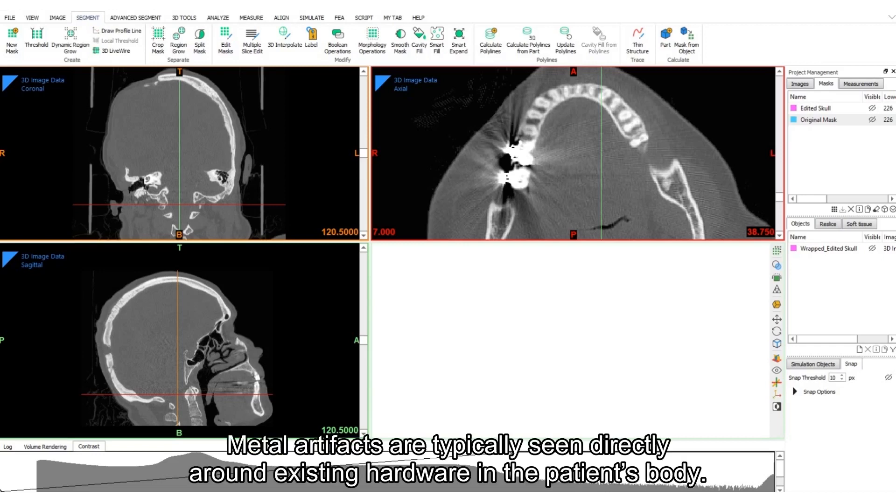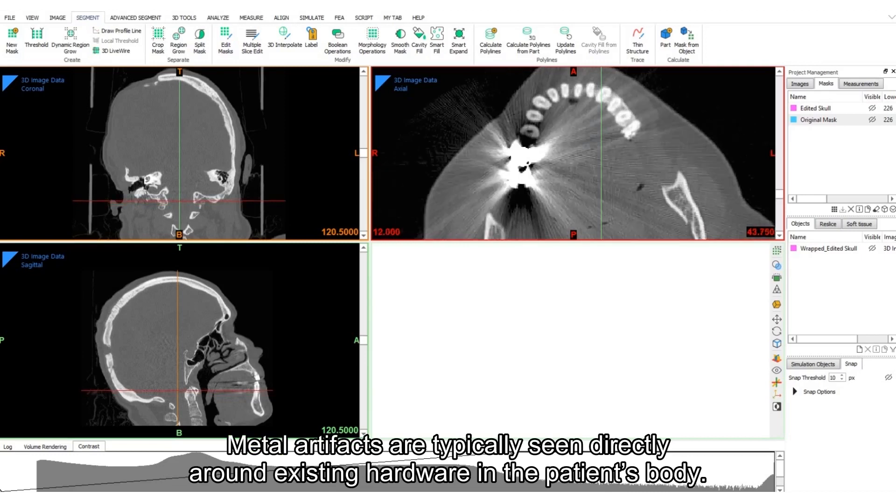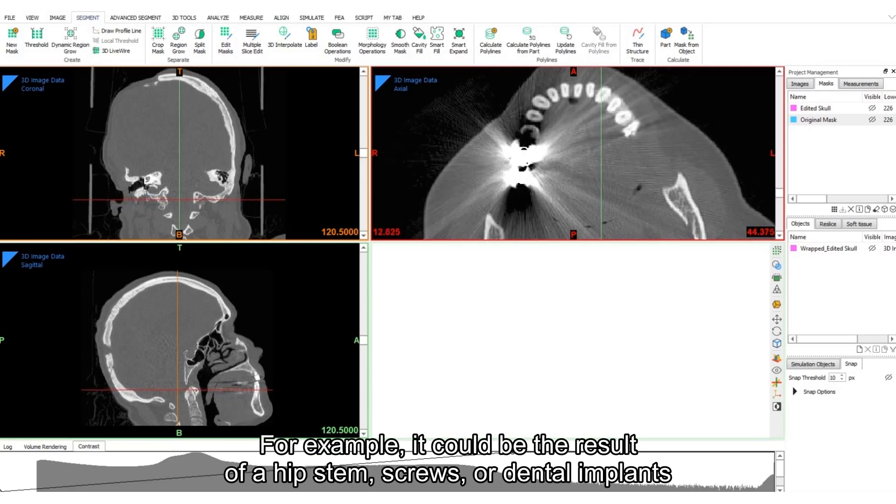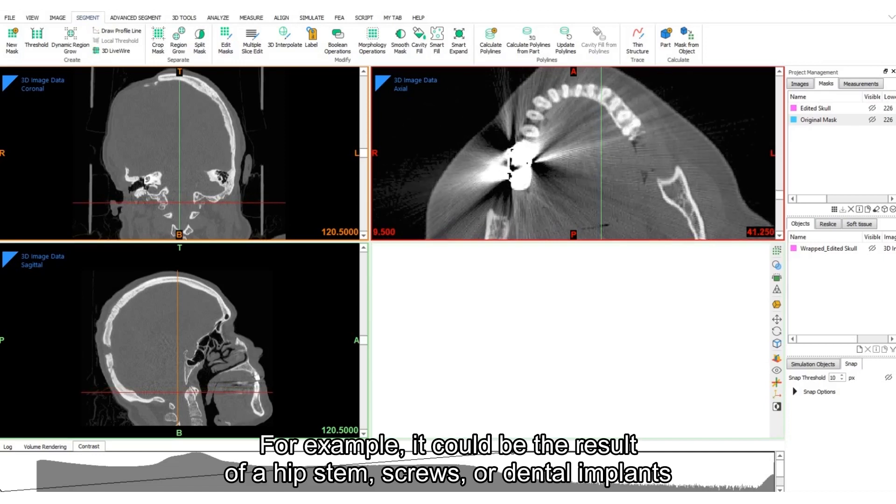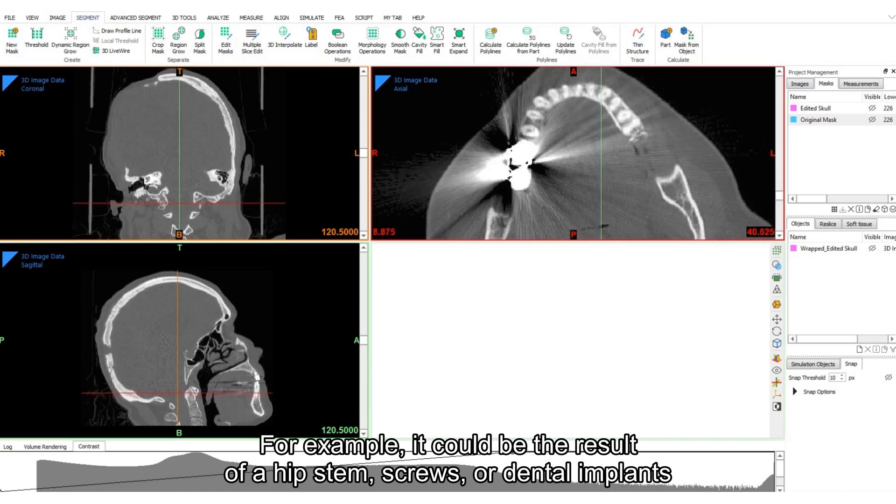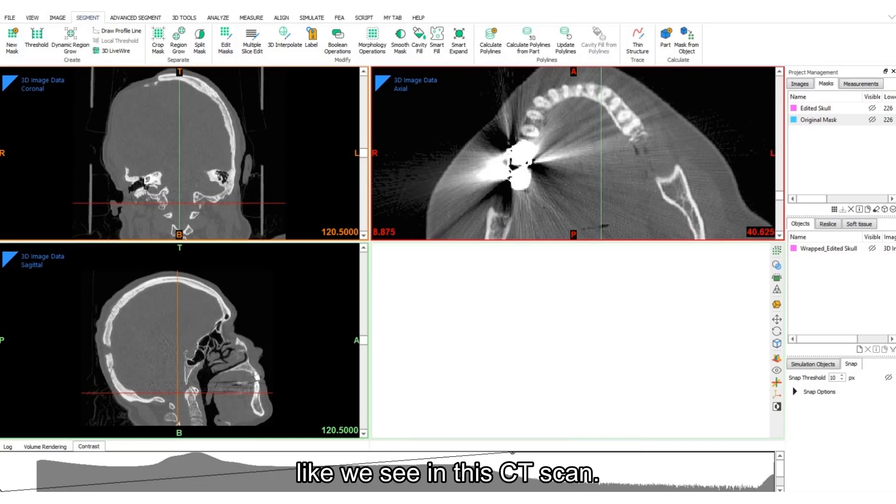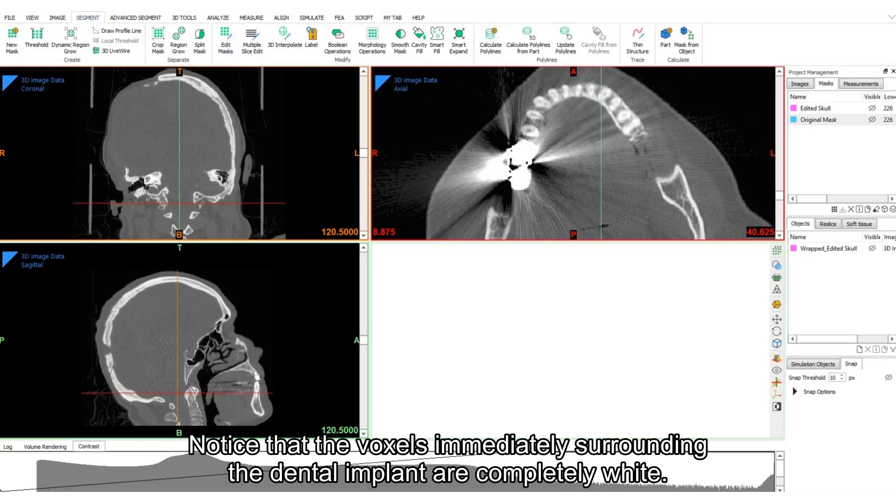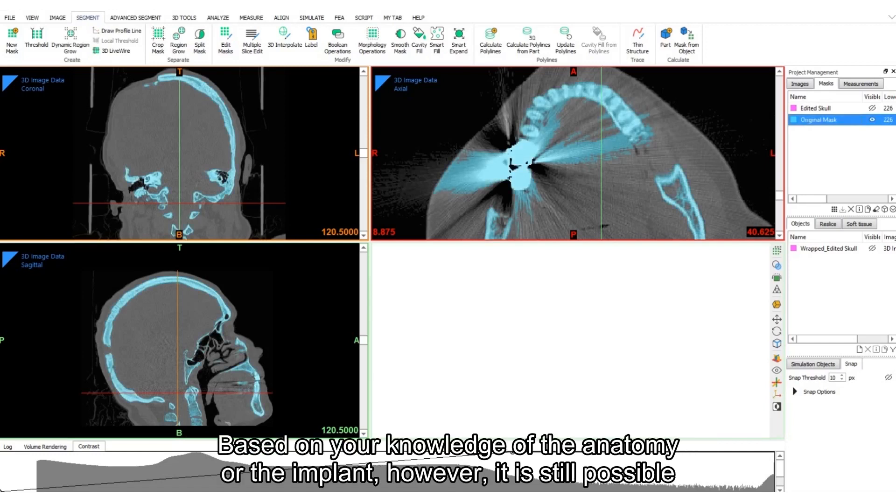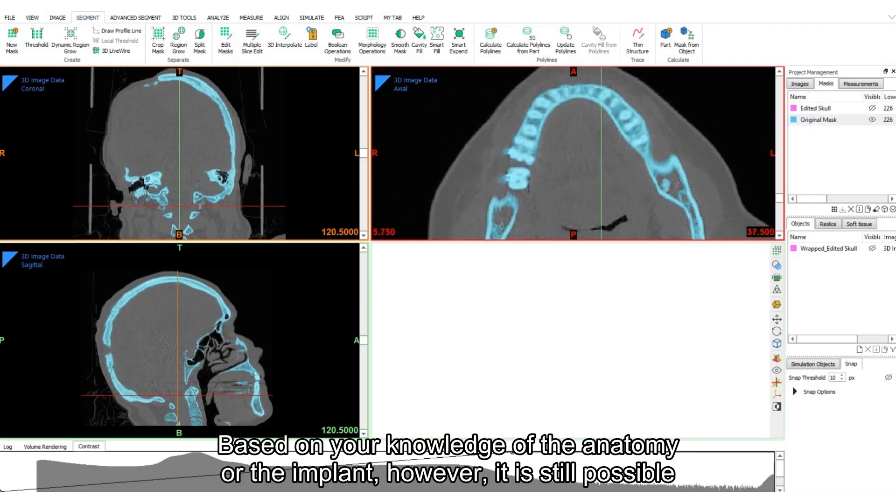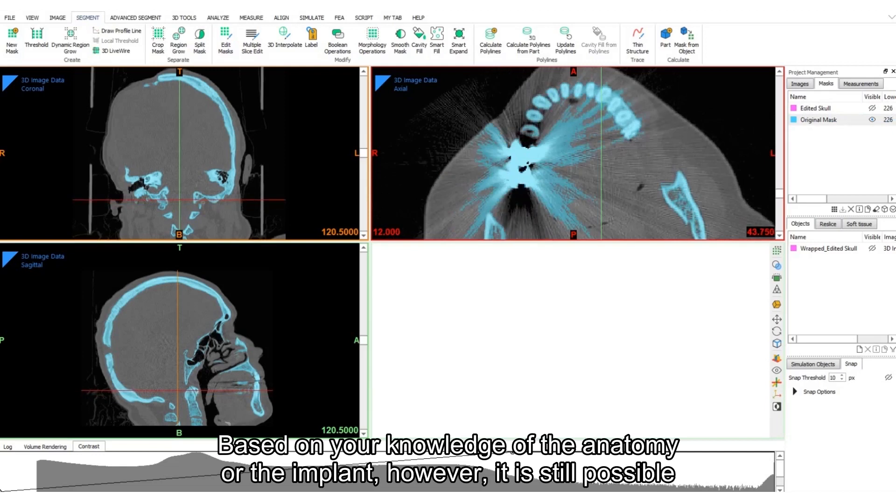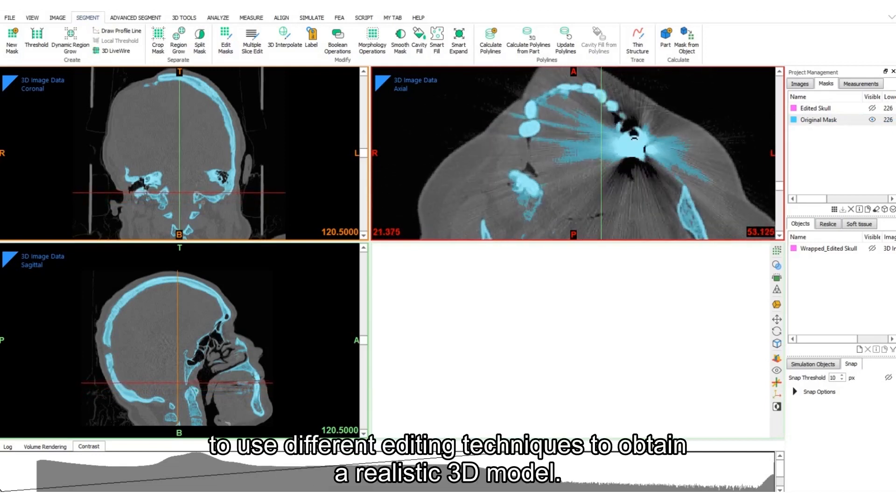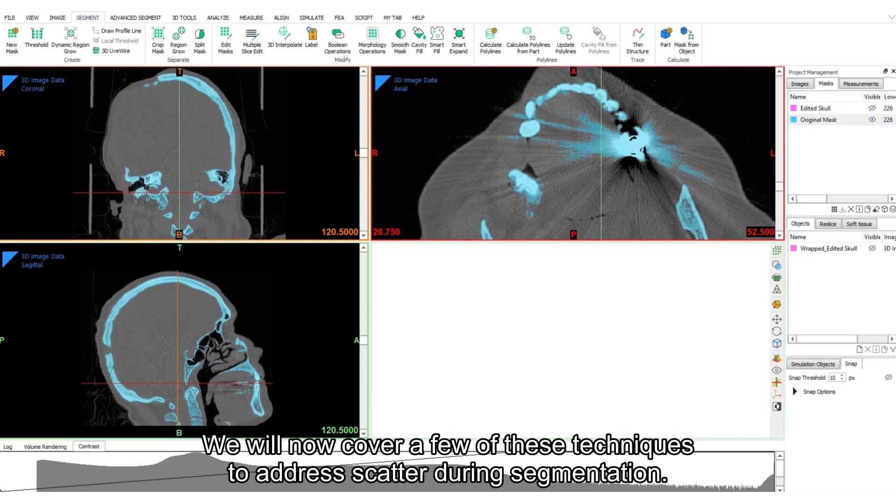Metal artifacts are typically seen around existing hardware in the patient's body. For example, it could be the result of a hip stem, screws, or dental implants like we see in this CT scan. Notice that the voxels immediately surrounding the dental implant are completely white. This makes segmentation using image intensity nearly impossible. Based on your knowledge of the anatomy or the implant, however, it is still possible to use different editing techniques to obtain a realistic 3D model.